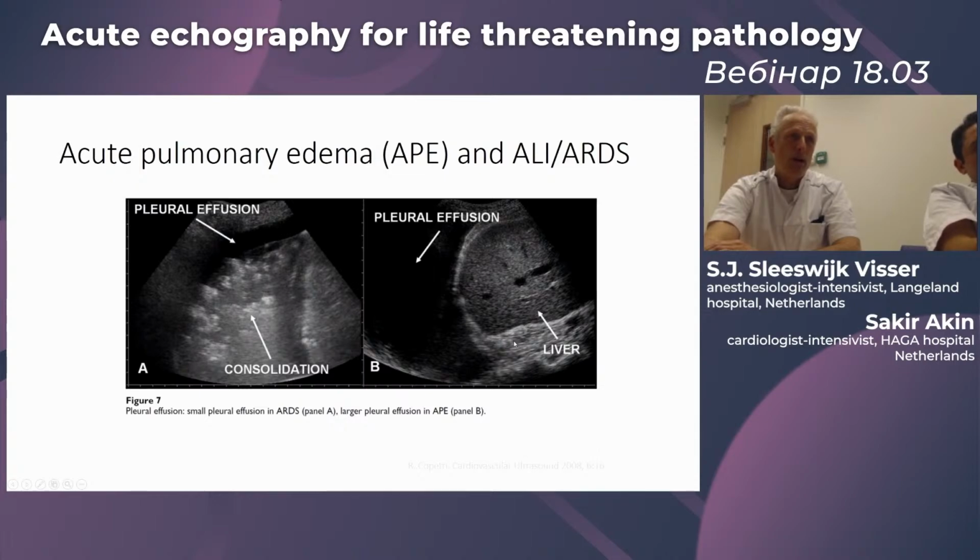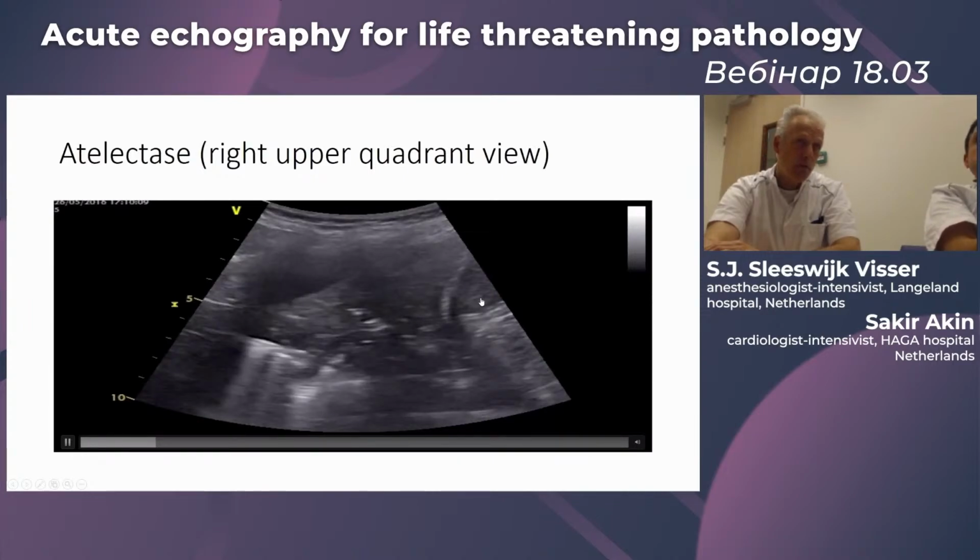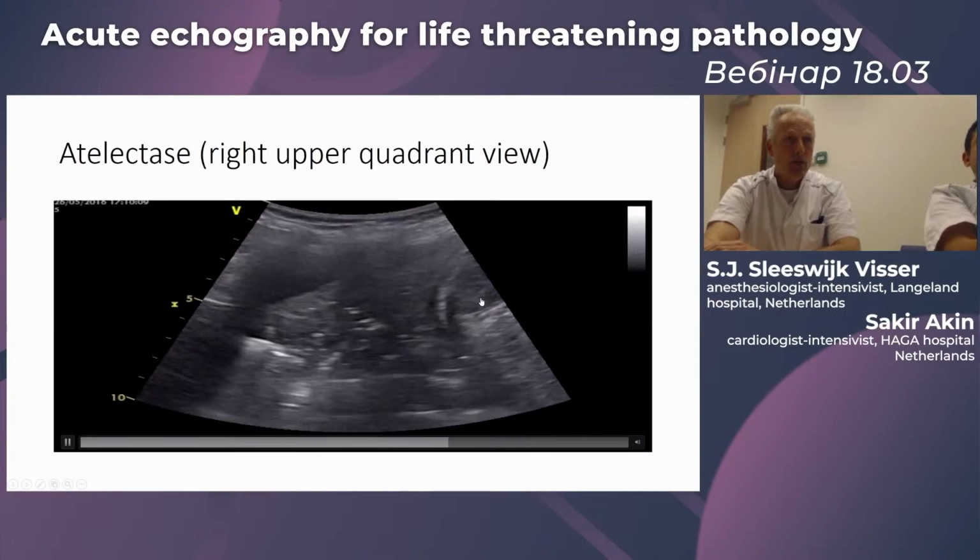Here's the diaphragm, here's the liver. And normally you would see nothing in the lung because it is full of air, and air is the enemy of echo. So if you see something dark, then it is fluid. And in a trauma, that will be most certainly blood. Again, here is an upper quadrant view of, well, this could be on the left side actually, the diaphragm, the spleen.